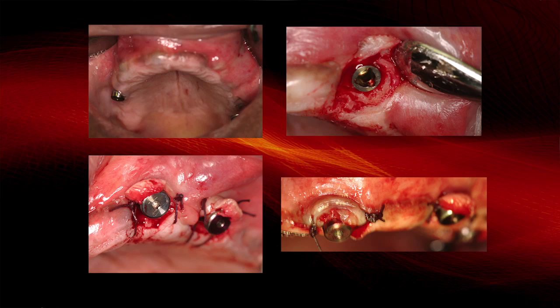So we see that the implants' trajectory came to the facial, and we don't want to use a tissue punch because then the buccal and labial margins are going to be in unsupported, non-keratinized tissue. So in order to do that, again, we're going to make our incision to the palatal side of the crest and bring the keratinized tissue to the labial, as you can see here. So this helps reduce the need for connective tissue graft. It's very simple.